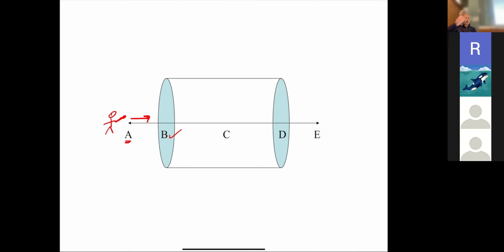Okay, well, let's say there's a hole in the magnet, right? There's a bore of the magnet. So there's nothing stopping it from going through the hole, right? Because that's where the patient goes through. Okay, so right, there's a hole. I should draw that. There's a hole here in the magnet. Okay.